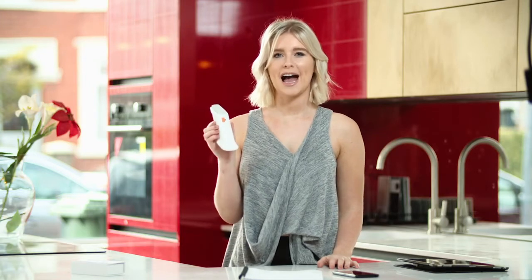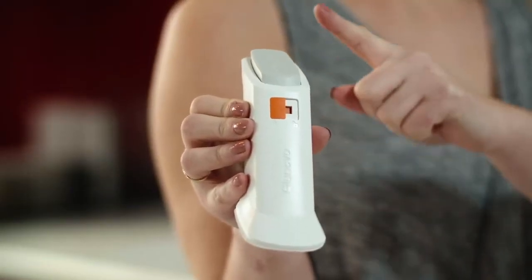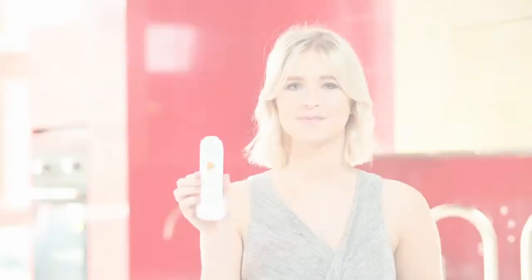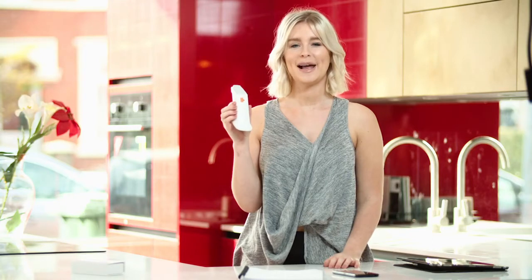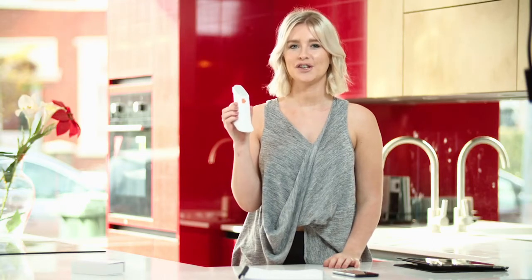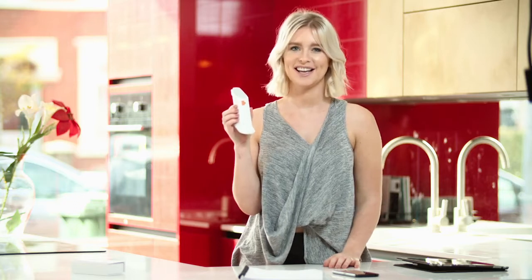This is the GluNovo i3 applicator, which has a sensor attached to the base. At the top of the applicator there is a button which applies the sensor to your body — but don't press this yet. The orange button should be in the locked position. When you're ready to apply the sensor, you push the orange button to the unlock position, but don't do this yet — we'll do this later.